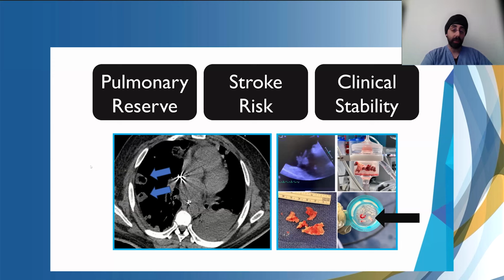Patient may be on a little pressor, then they leave. But most of that usually resolves in 24 to 48 hours, at least for us. So I do actually consent patients that you may get slightly worse for a day before you get better. So we have seen it, but I'll be honest, the degree of intra-procedural, post-procedural SIRS-like phenomenon is variable. I haven't found a good way to risk stratify or predict it. I don't know if you guys have.